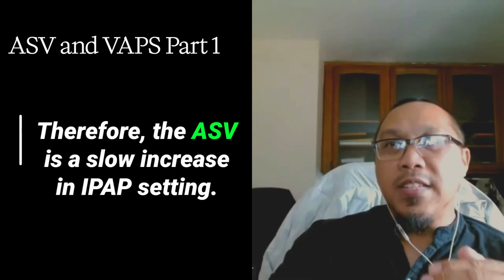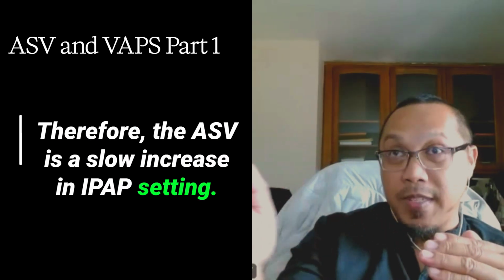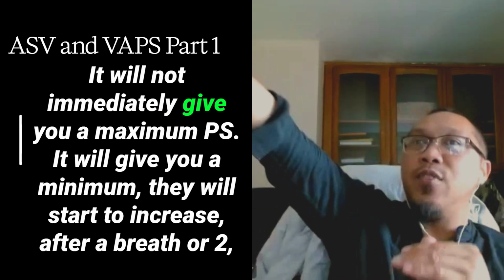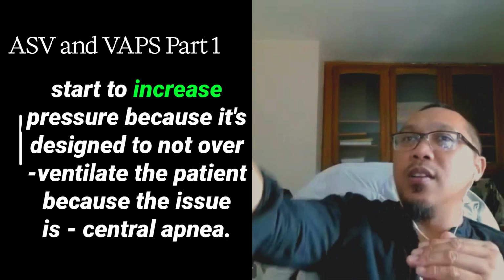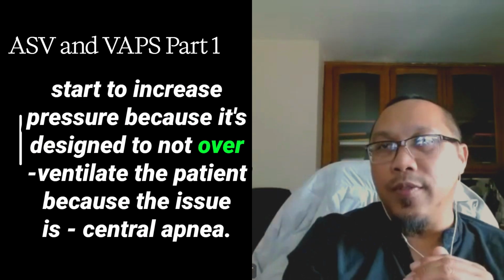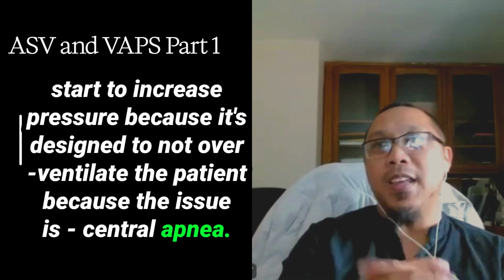Therefore, the ASV is a slow increase in IPAP setting. Okay, it's a very slow increase. It will not immediately give you a maximum pressure support. It will give you a minimum. They will start to increase after a breath or two, start to increase pressure. Because it's designed to not overventilate the patient because the issue is central apnea.